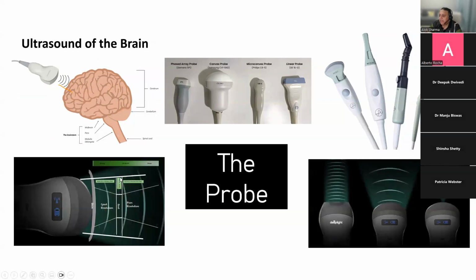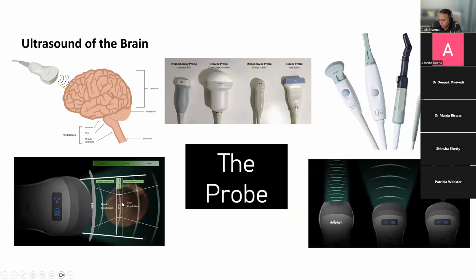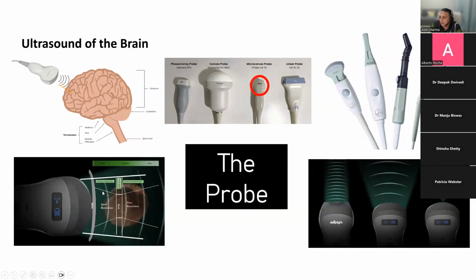Again, just a bit on the focus. So why do we have a focus? Because we want to obtain the best near field image. And I will talk about that when I talk about advanced ultrasound physics, is that really the advantage of having the focus button is it helps to concentrate those ultrasound waves which are diverging outwards. Because they're diverging outwards, you're getting poor resolution with the same frequency. You can actually get the focus button to focus them to the point of your interest.